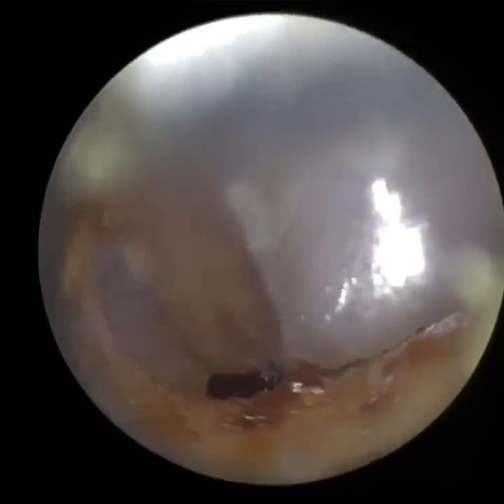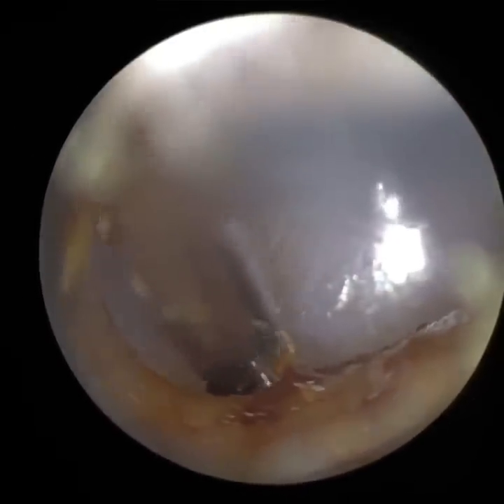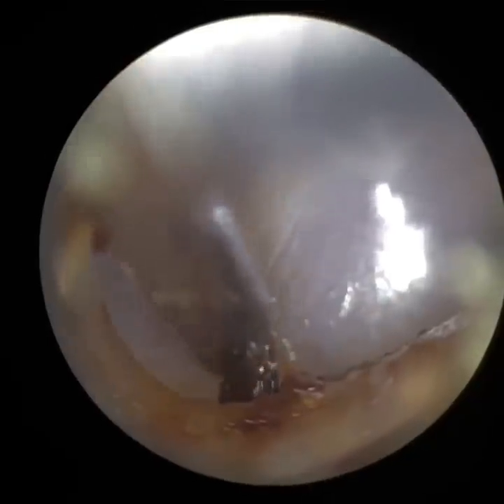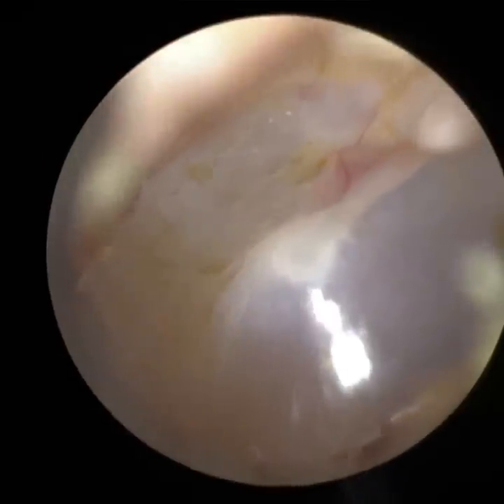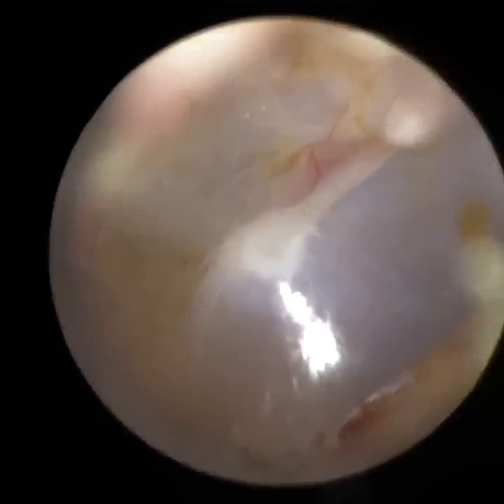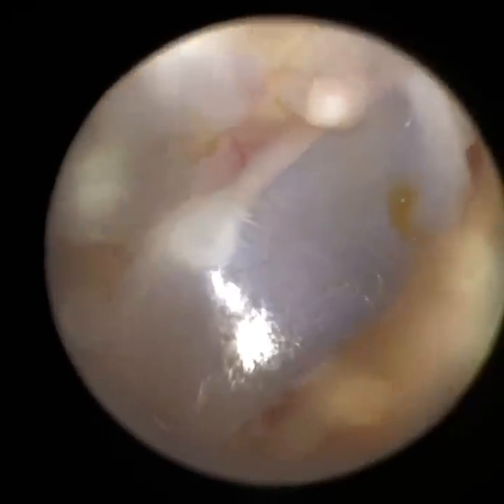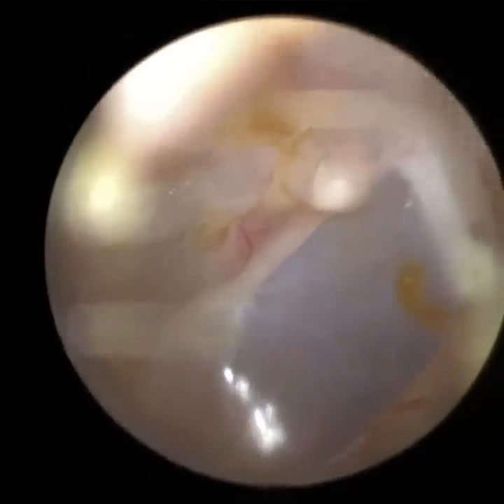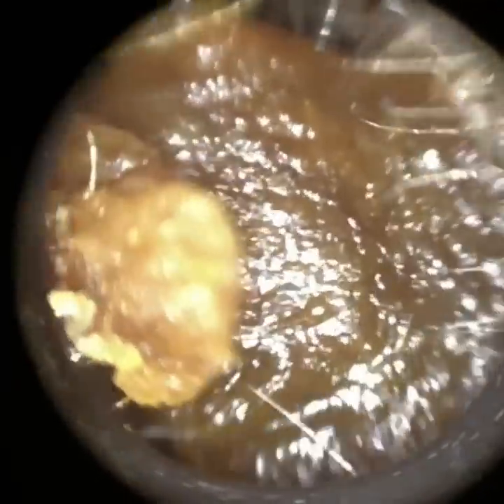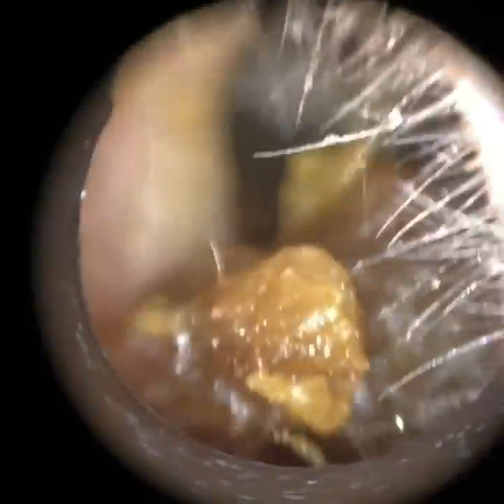If you've been following my posts on Facebook, LinkedIn, Instagram, or even TikTok, I've been uploading some images recently of the eardrum — the anatomy, the physiology. I was talking about the middle layer of the eardrum, the fibrous layer called the lamina propria. There you've got concentric, oblique, and radial connective tissue — fibrous connective collagen tissue — that almost forms a spider's web configuration on the main body of the eardrum, giving it rigidity and strength. In this particular patient, you could actually see those radial fibrous collagen connective tissue in the middle layer of the eardrum. Right ear is clear.